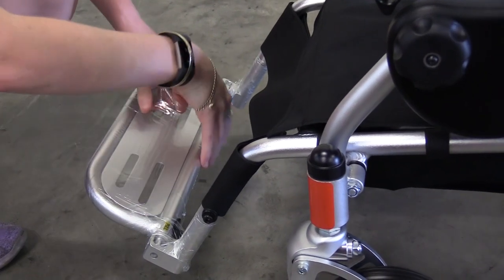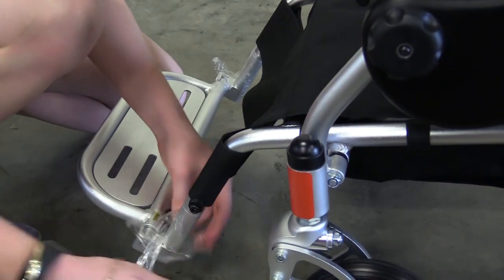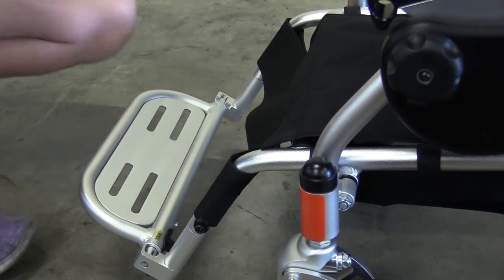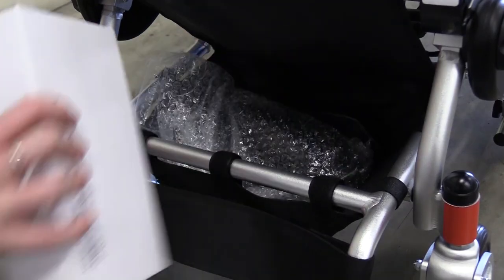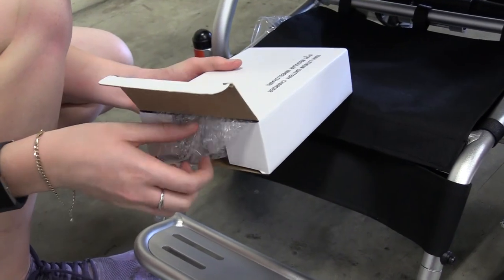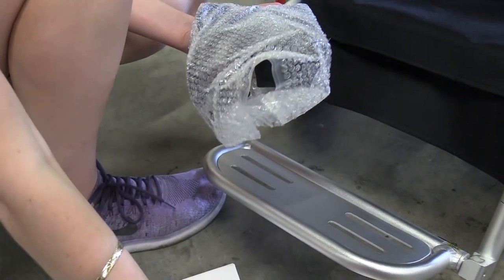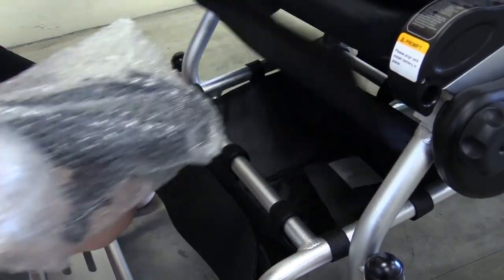Your Companion's footrest will be wrapped to protect it from scratches in transit — remove this packaging before use. Your Companion also has a storage compartment below your seat. This is where you'll find the battery charger, user manual, and the control panel.